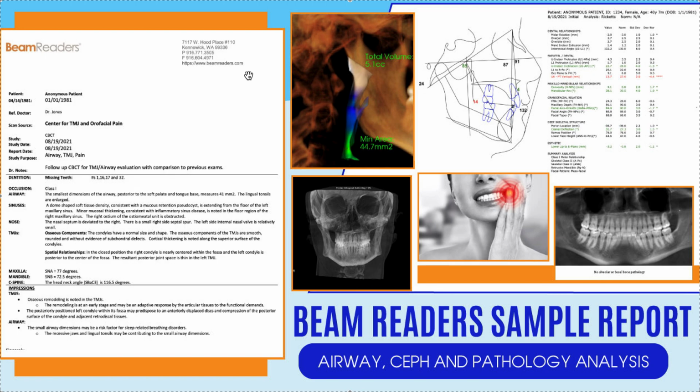So there's a lot of you, which I think is amazing, that you're taking this on every single ortho patient, and you're having a company like Beam Readers read every single ortho patient. For me, that's incredible. Yeah, maybe it's 100, 150, but talk about being able to sleep well at night, doing your due diligence, making sure your treatment plan is holistic in nature, and really helping the patient in all different aspects, not just making them smile nicely, but making them function better, making them sleep better. So that's the benefit of a service like this.